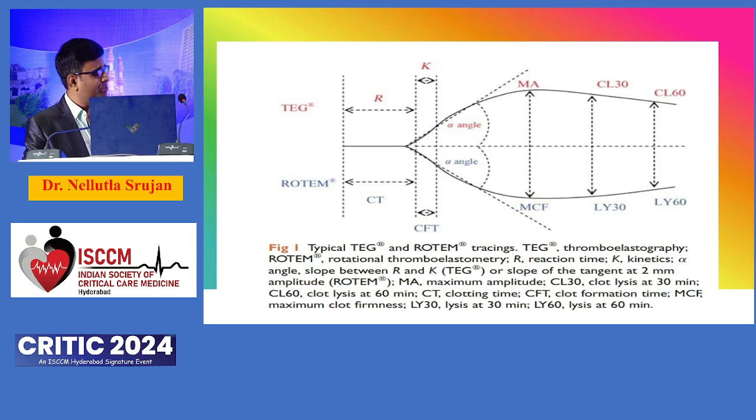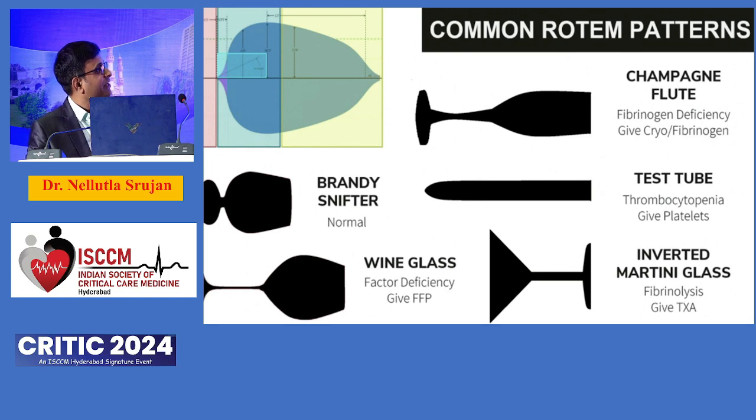This is the difference between the two, TEG and ROTEM waveforms. The only difference is the nomenclature. Otherwise, the waveform almost remains the same. And the common ROTEM pathways are assimilated to our day-to-day activities so that we can easily remember them and the treatment to be followed.